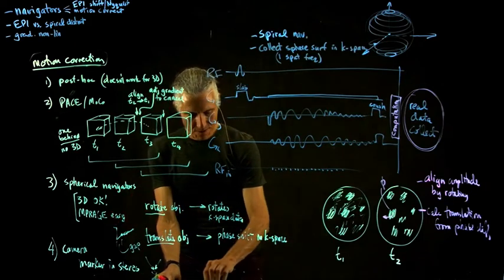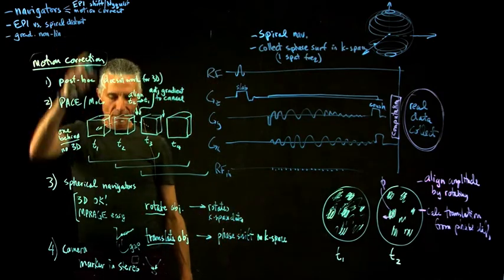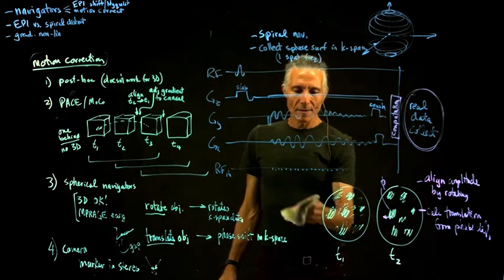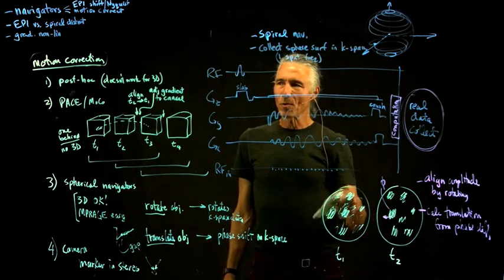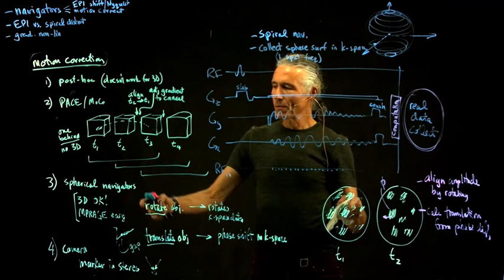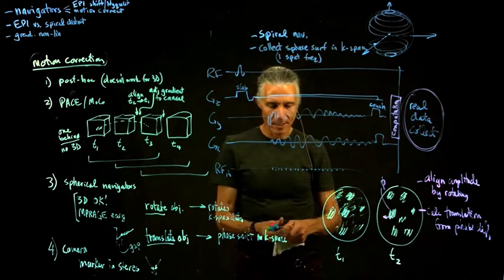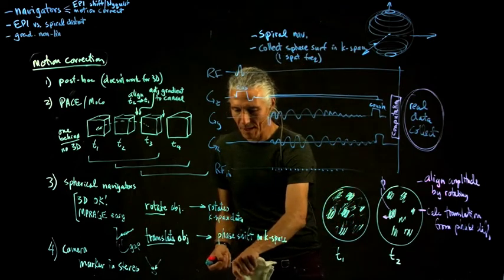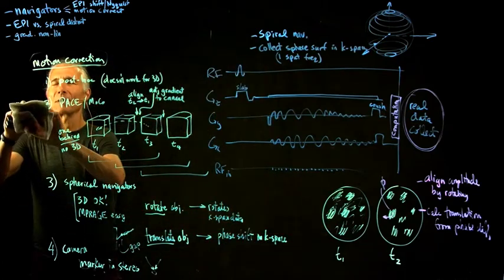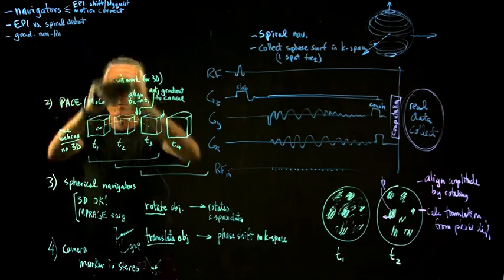Okay, so that was a quick summary of navigators. There's something that was written at UCSD called Promo that does something very similar to this, for doing motion correction in an MP rage scan. That was written by Nate White. I'm pretty sure I have that reading if you want to see in detail how that works.